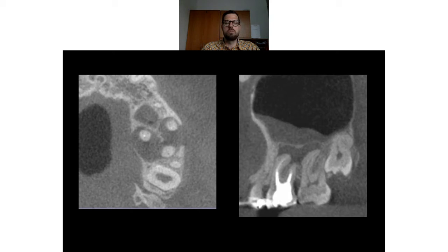And we know that, for example, this will seal a long time. So if we take an X-ray, for example, in half a year, we will not see total healing. We must wait. And yes, in 1 year, I will take here a small field of view CBCT just to be sure that it's well healed, and also what is the situation in the antrum.